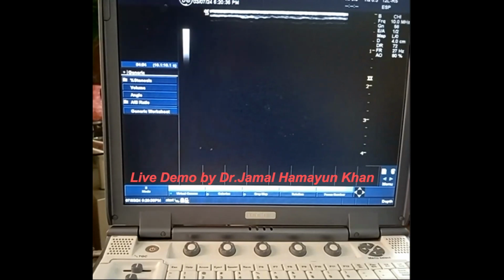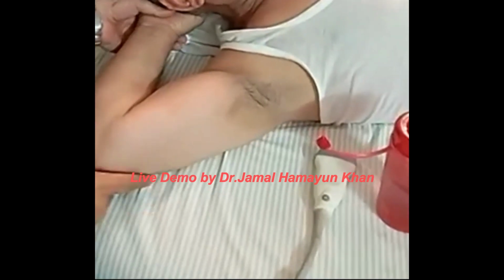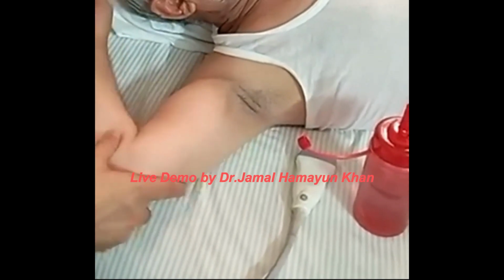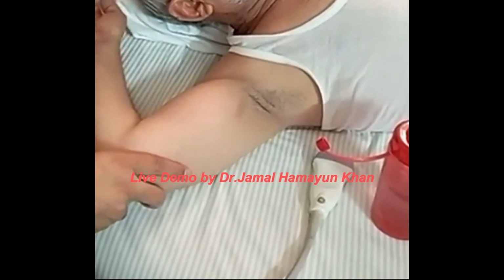Now we'll be moving towards the axillary brachial plexus block. First of all, I'll show you the patient position. The position is to keep the hand below the head. But if there is trauma of the hand, fractures, or abscess, or there is an injury of the hand for which you are going to perform the surgery, it's fine. You can keep it like this.